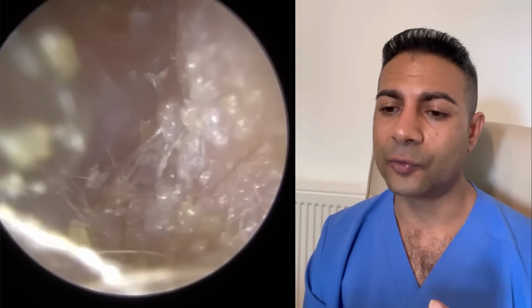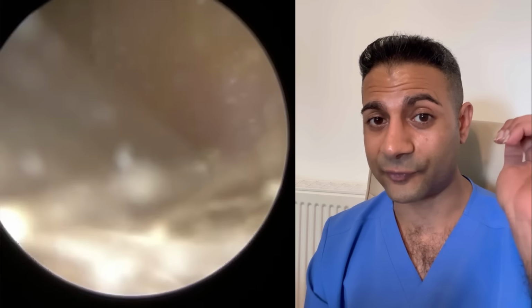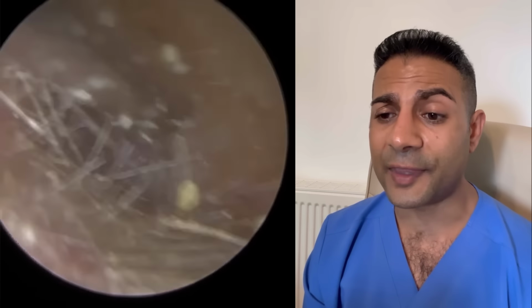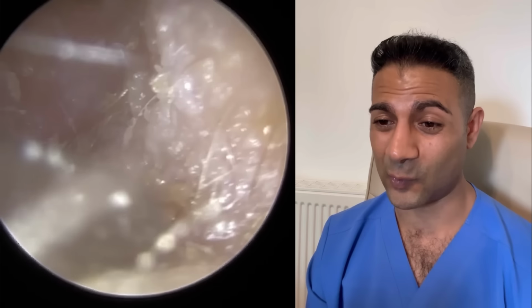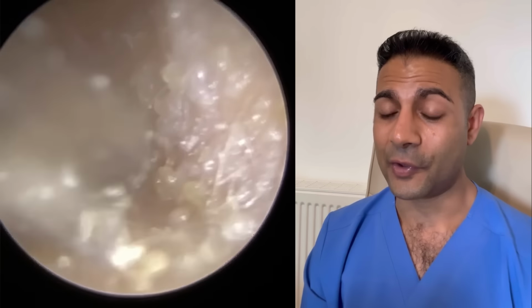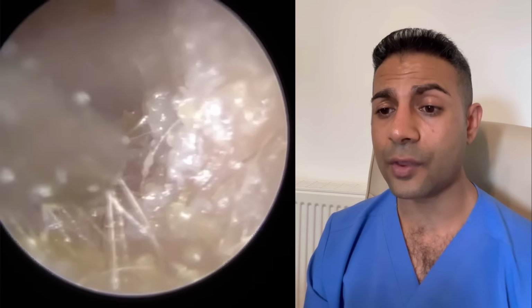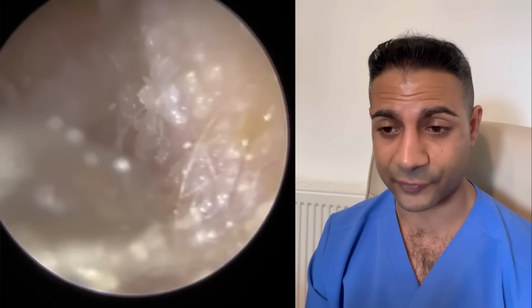Also importantly, the skin that lines the bony part is just the epidermis layer, that most superficial layer, and it's about 0.1 millimeters in thickness. So it's one tenth of the thickness of the skin that lines the outer third. Therefore, the bony part of the ear canal is far, far more sensitive.